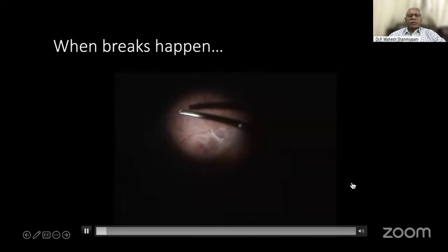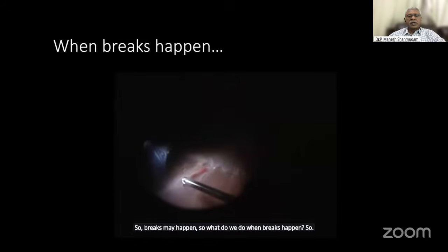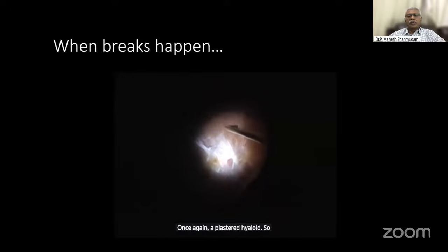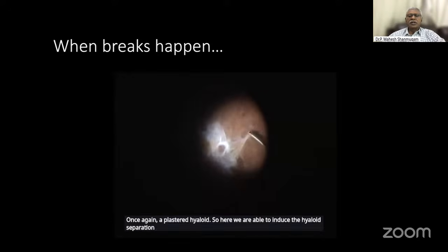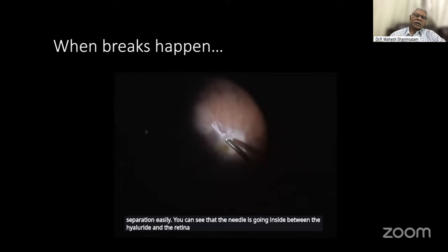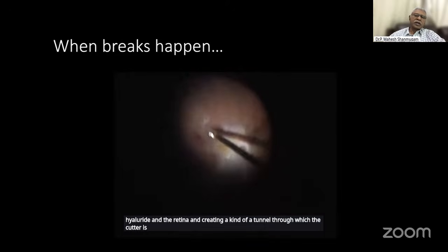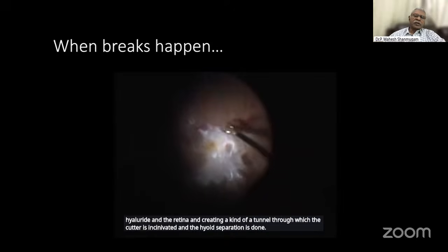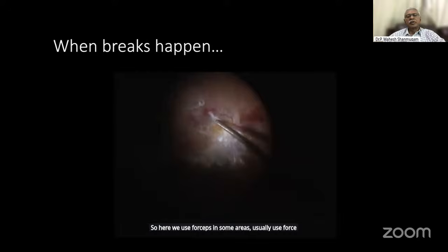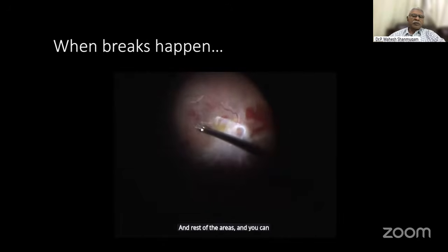So breaks may happen. What do we do when breaks happen? Here we can see once again a plastered hyaloid, and we are able to induce the hyaloid separation nasally. You can see the needle going between the hyaloid and the retina, creating a kind of tunnel through which the cutter is insinuated and the hyaloid separation is done. Here we use forceps in some areas to peel the fibrovascular proliferation over the disc and the rest of the areas, and you can see it being peeled off from the macula.